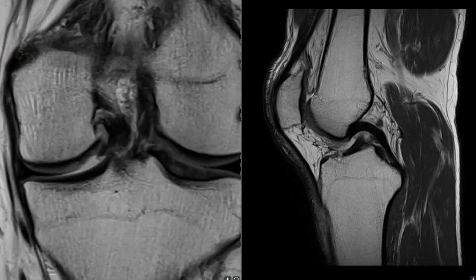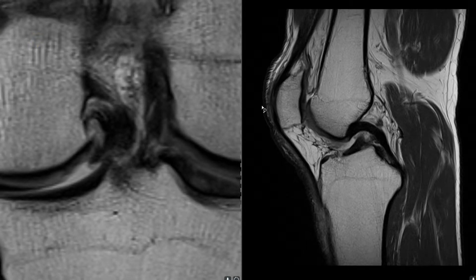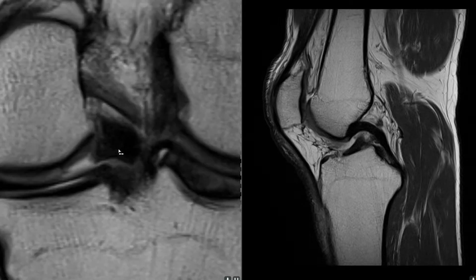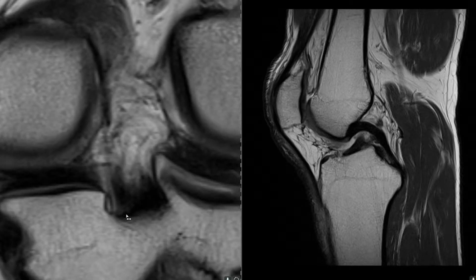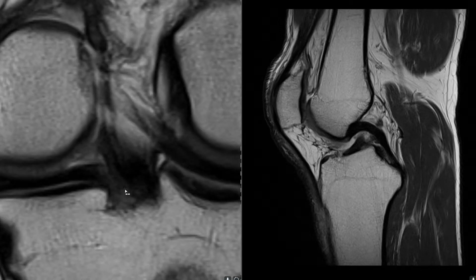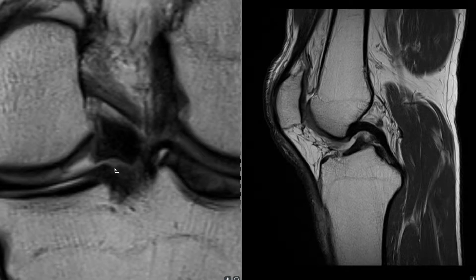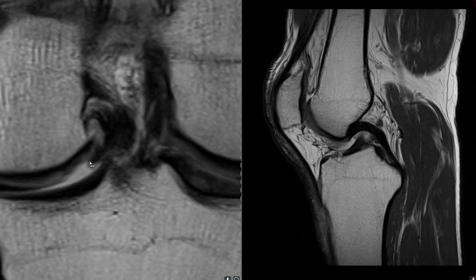Let me make this a little bit bigger. This is the PCL running through — that's the insertion. Going back again, we have this black structure interposing between the medial femoral condyle and the tibial head.